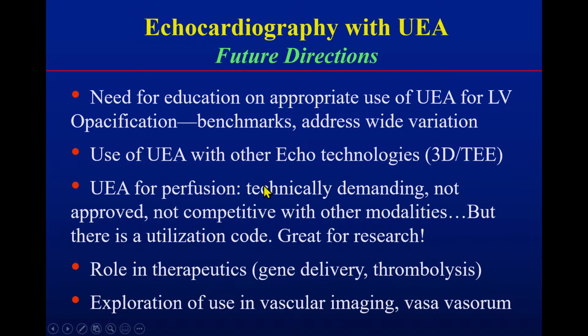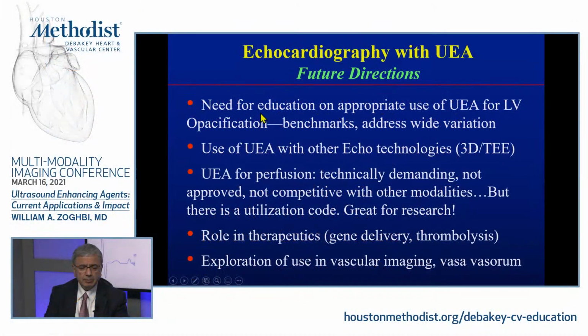So I wanted to conclude and give you a feel of future directions in the field. Number one, looking back at the field itself over the past few years, education has really paid off. It has been slow overall, the adoption of ultrasound enhancing agents. But I think the more we know about safety, availability, and most importantly diagnostic impact, the diagnostic impact because of quality. We're doing these studies anyway.